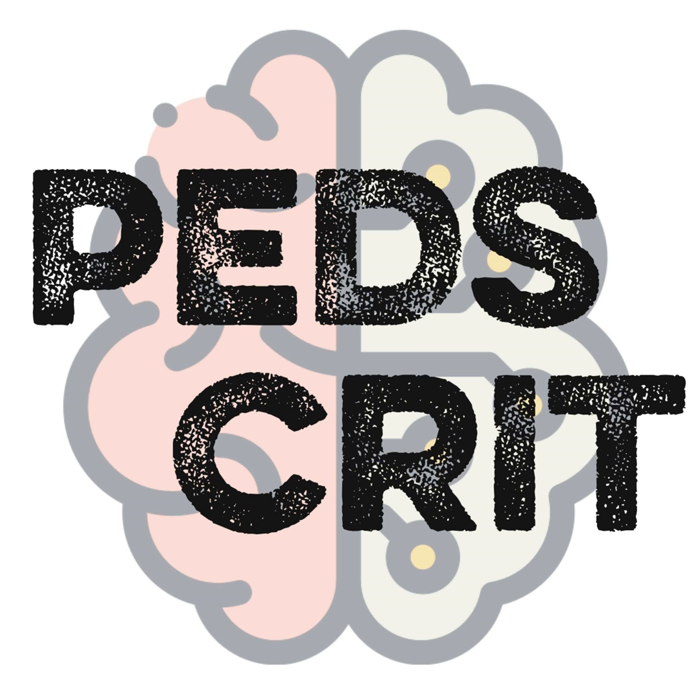So eventually, you could think about basically getting to a constant CPAP level, and you can actually extubate from APRV. You don't need to transition back to conventional ventilation. Some might transition just mostly out of comfort, but you certainly don't need to. You can extubate straight from APRV on a CPAP level.